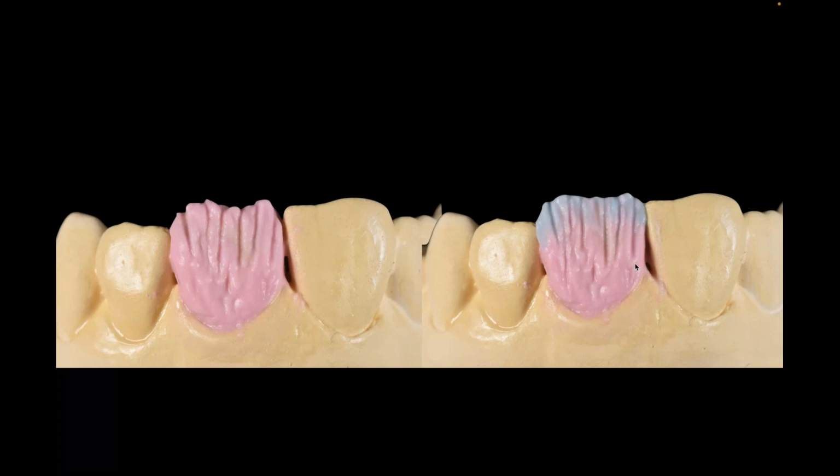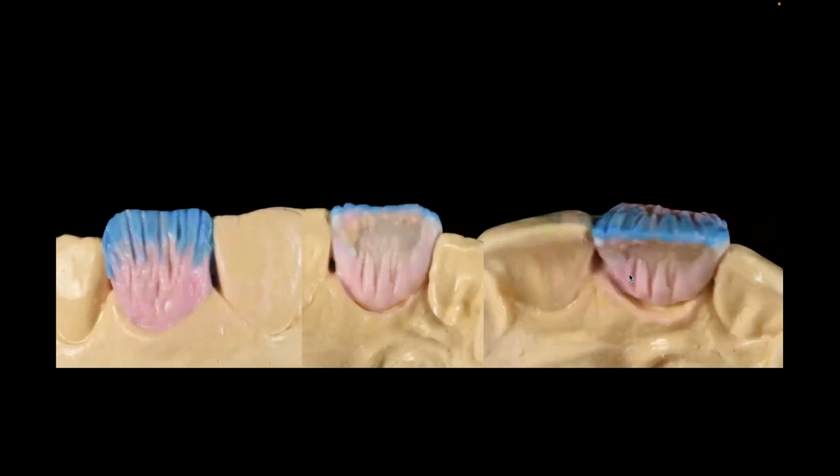So hindsight is always better for us, but looking at that now, my brain just went to, oh, you should have brought that down a little bit more. And even here, I would argue that I probably could have come down a little bit more with my effect translucency to get a better transition. This is not a real case, I don't think. This might have been, this is a course model case, actually.